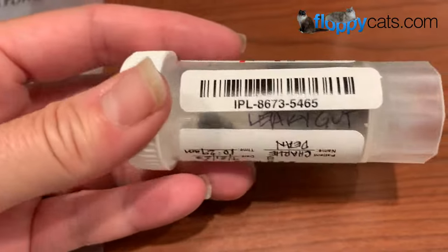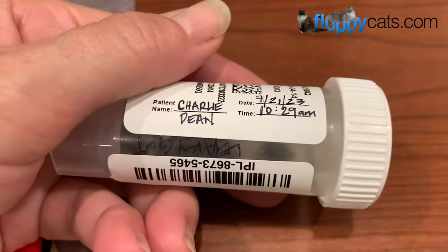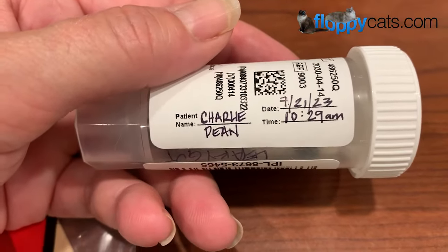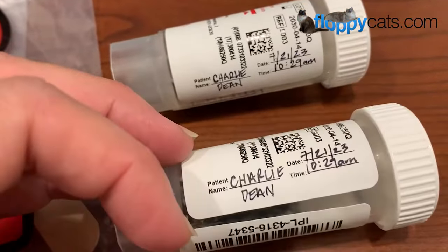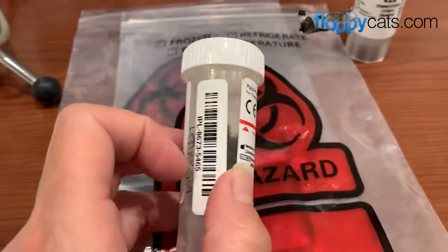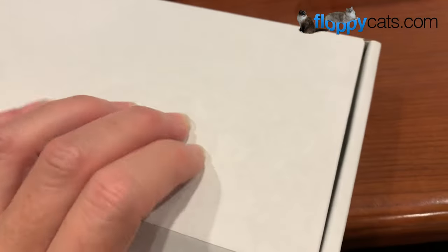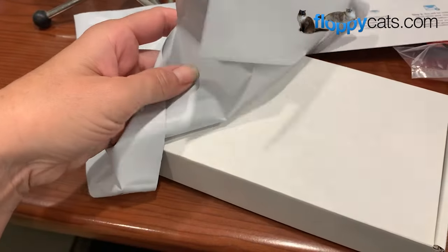What you could also do is just write 'leaky gut' on the tube if you pulled it out of the box — not on any of their printing, but on the plastic that's fine. I've also added Charlie's information on the tube as well. The next step is to make sure the tubes are tightly sealed, then put it in the biohazard bag, roll up the biohazard bag, and put it back in the box it was shipped in.